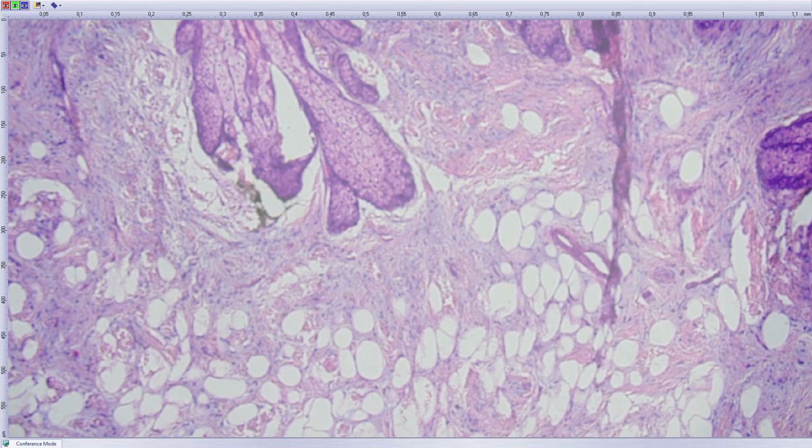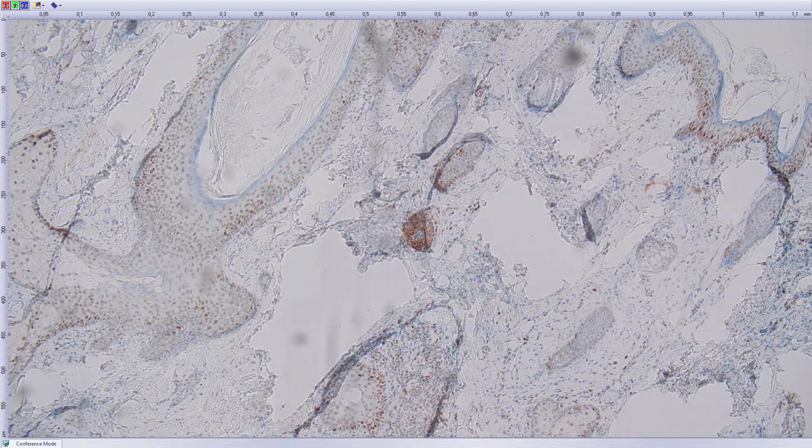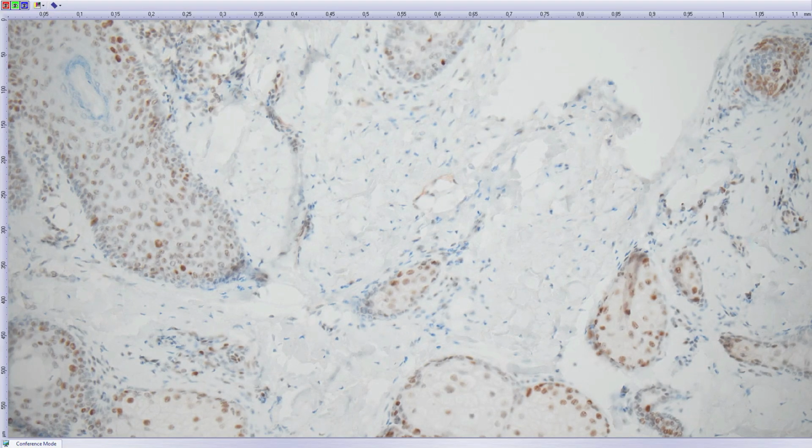And as usually, this spindle cell lipoma is having retinoblastoma protein deficiency. Here you can see staining of retinoblastoma protein. You see that the reactive lesion of sebaceous gland and follicular lesions are positive, but stromal lesions are negative. So this trichodiscoma with hyperplasia of sebaceous and follicular components, and the stromal lesion is spindle cell lipoma, which is RB1 negative, and all of that is reactive.